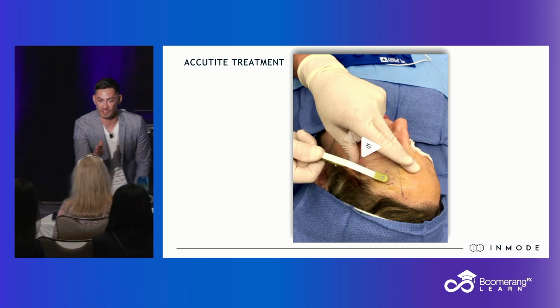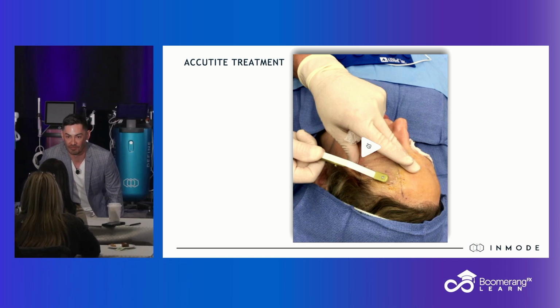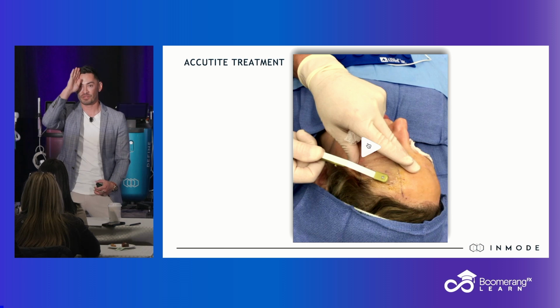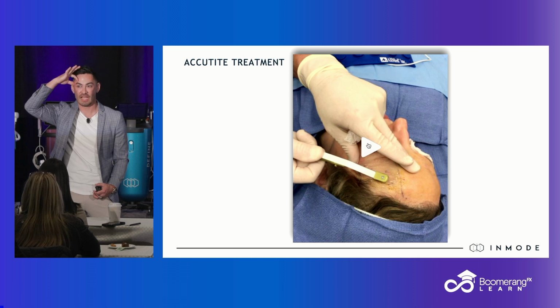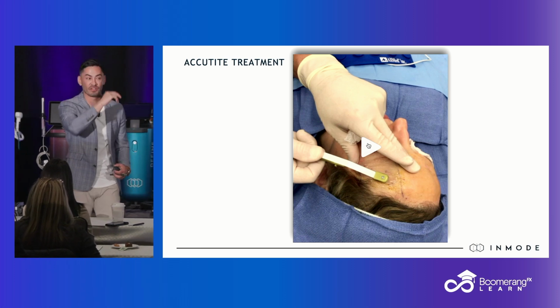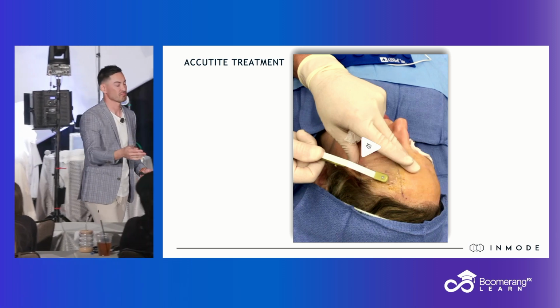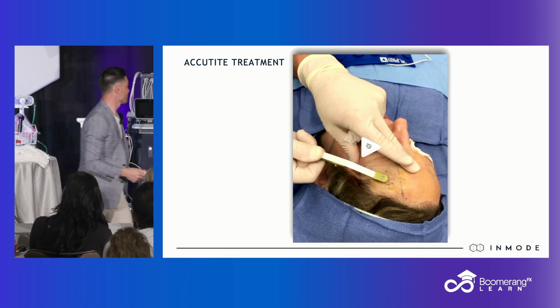So when you look at your patient, you got to look in central gaze. Central gaze is when your nose and my nose is lined up. We're looking eye to eye. And then I draw a line, a mid-pupillary line. Middle of the pupil straight up to the hairline. Mid-pupillary line, tail of the brow. You treat in between those two lines. That's what you treat. AccuTite, just a little bit of local. Morpheus, 2 millimeters of lift is what I can reproduce time and time again. 2 millimeters is a lot when you're talking about a brow. People notice that. They notice that with your Botox. Some do. If they notice it with their Botox, they will absolutely notice it with the AccuTite. How about that? That's fair to say.